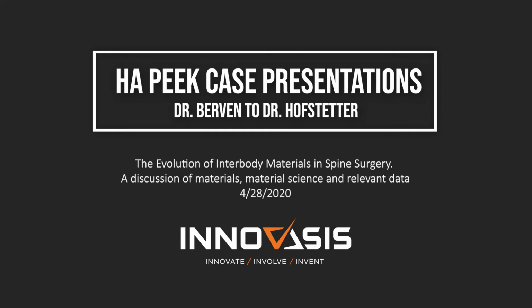So I want to give back to you, Sig. Yeah, terrific, Christoph. I appreciate you sharing those cases. A very nice job on the cervical spine. One of the troubles I've recognized in the cervical spine, certainly with my ACDFs, is I typically use a fresh frozen allograft. Recently, we've had to use some freeze-dried allograft, and I've really had trouble with the brittleness of some of the freeze-dried allografts. Have you had trouble with implant breakage on insertion with either, certainly with the HAP? I haven't seen it, but with other materials?